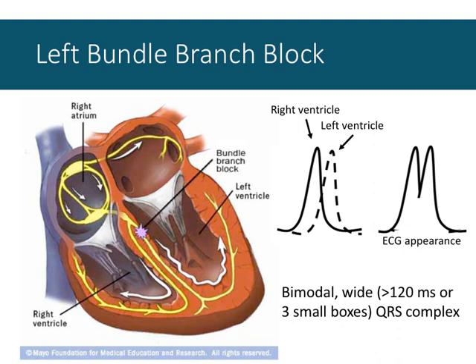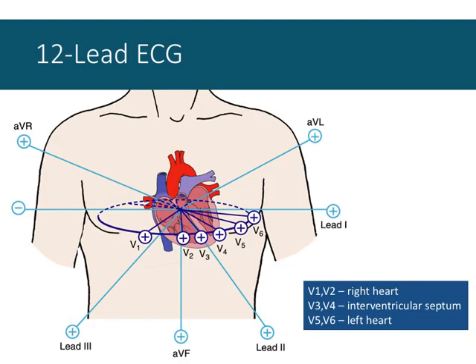I have this rush of activity down the septum. I see very quick depolarization of the right ventricle. The last thing I see is the action potential spreading through the tissue on the lateral wall of the left ventricle. That's the last thing I see as the heart contracts. And so the last thing I see is this potential moving away from me in V1 and V2 over here, moving away from me as the heart contracts. So depolarization, positive wave away from a positive electrode gives a large negative deflection.